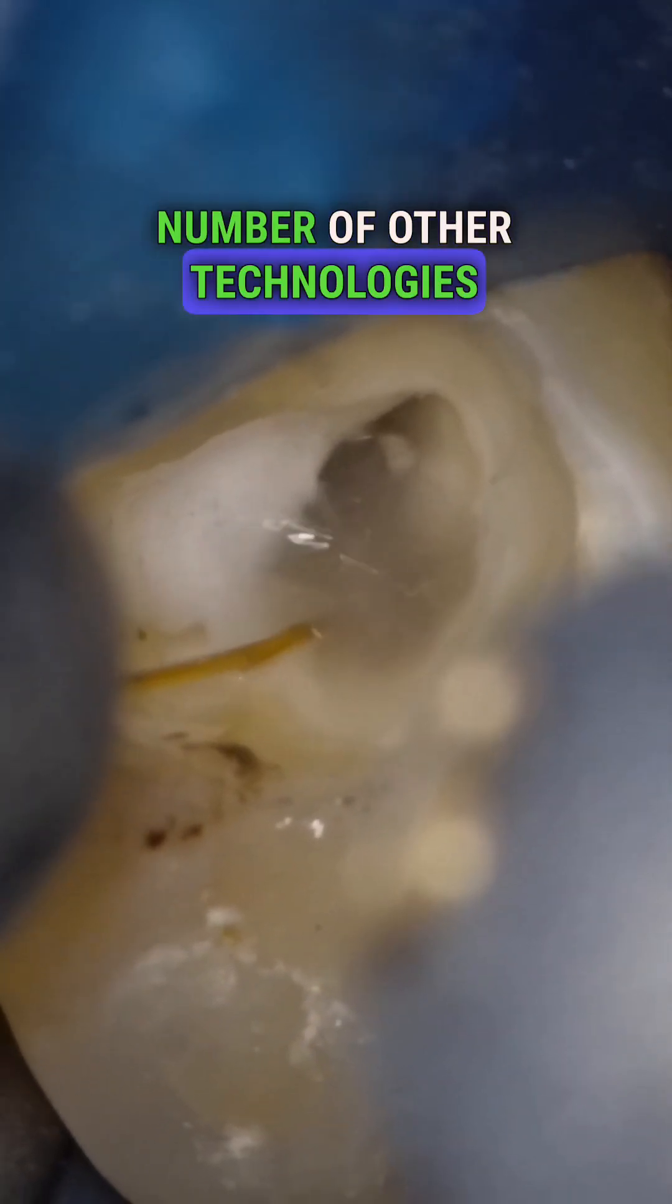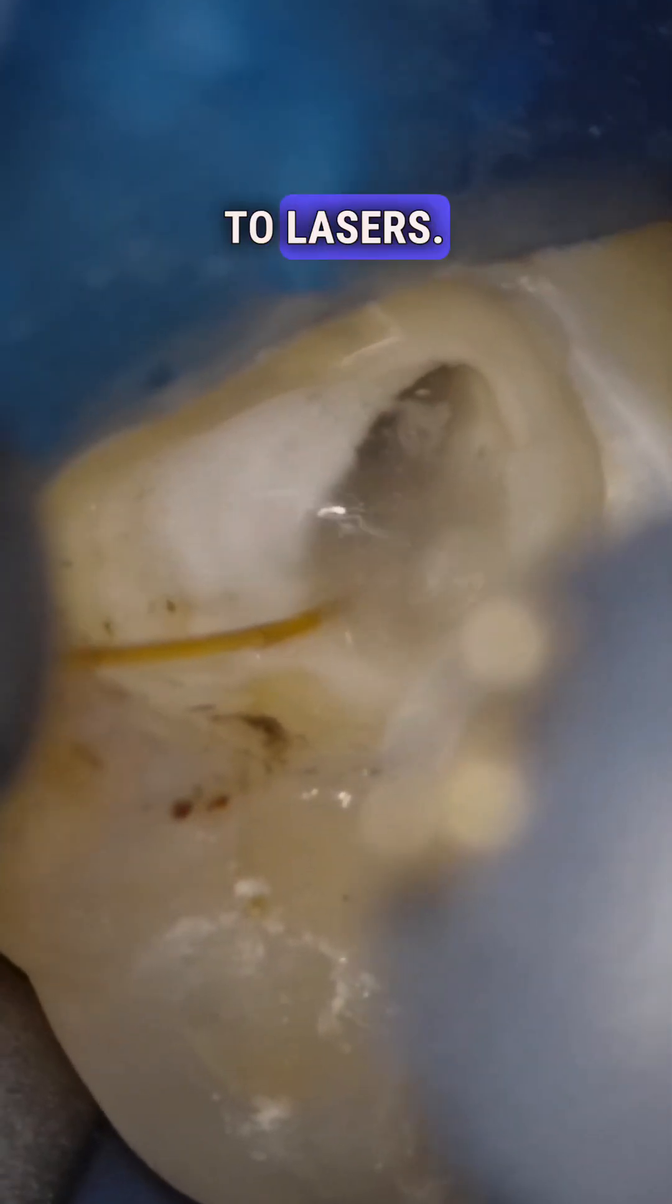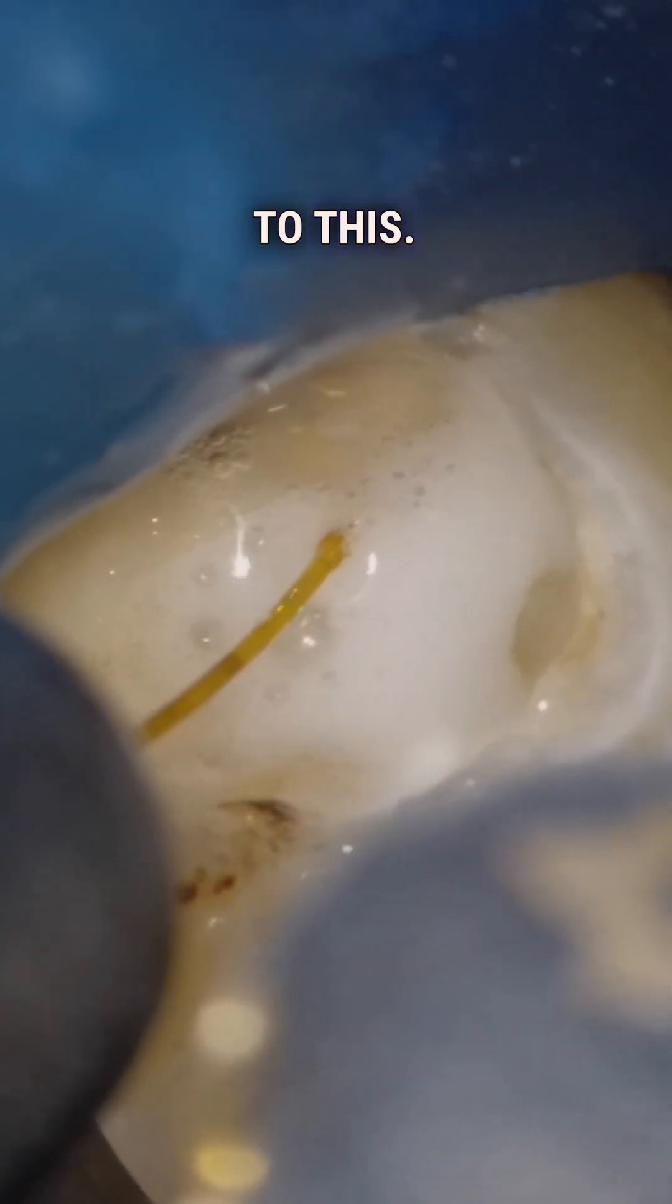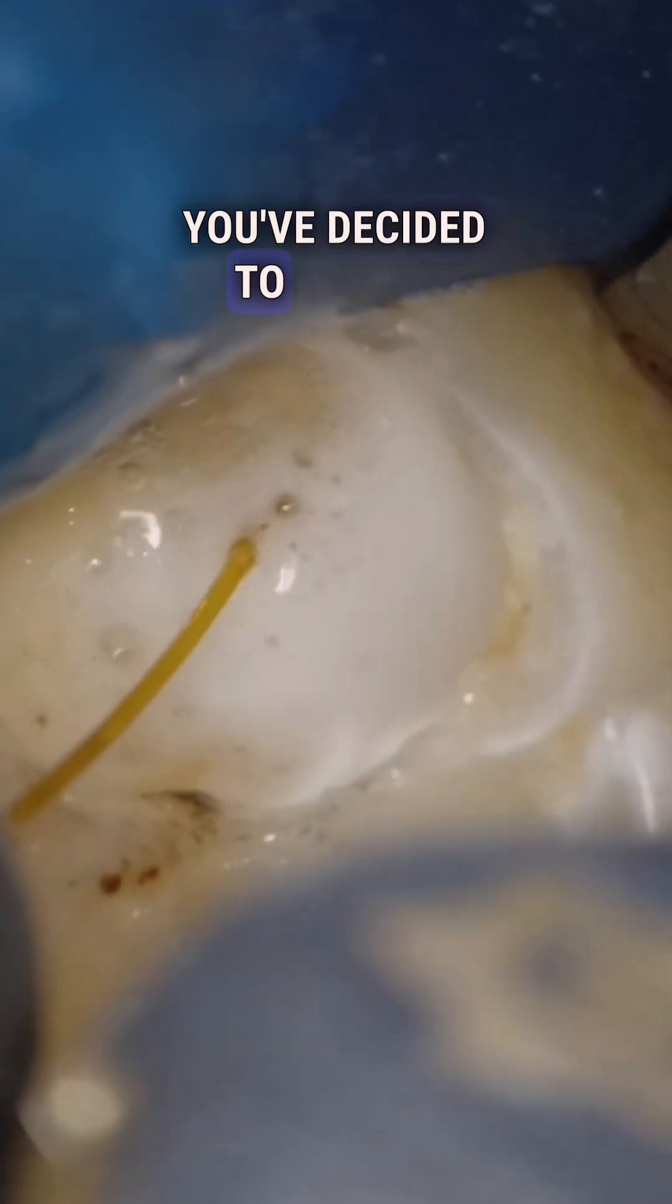Now, there are a number of other technologies that have come out in regards to lasers. Some use a technique where you would hover the tip in the coronal chamber. Others would work similar to this. Depends on what you've decided to adopt.